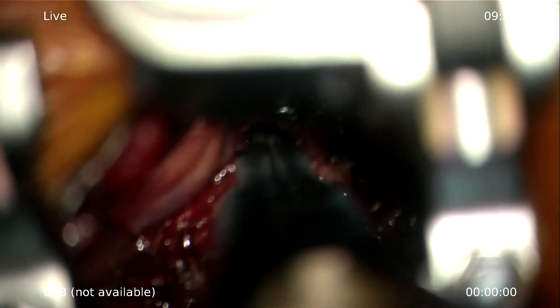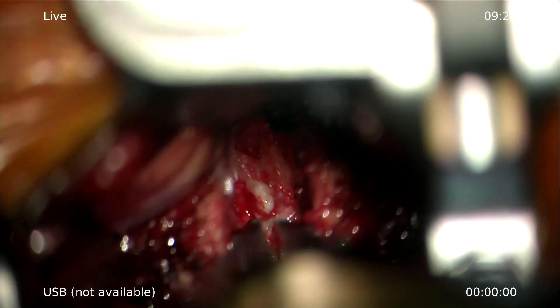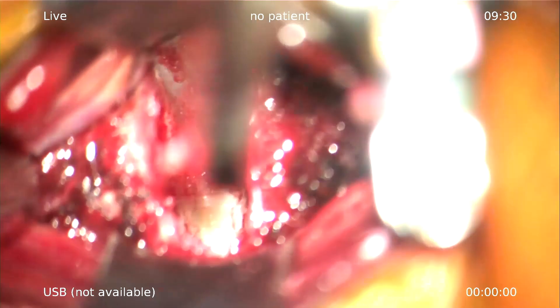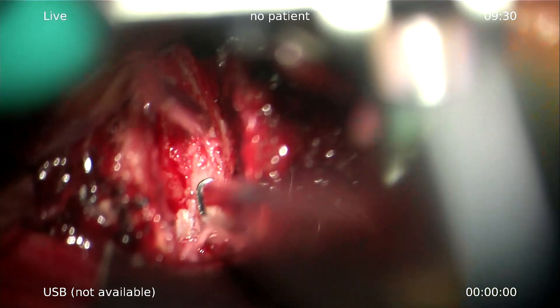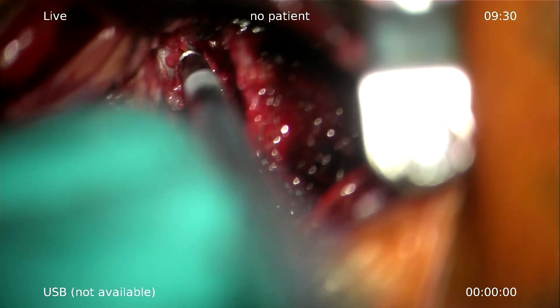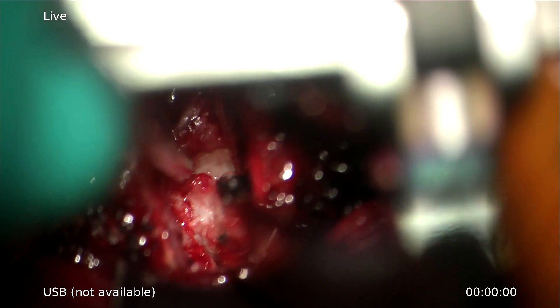If your release is good on both sides, you see it opening nicely in the middle. Of course, you need to do a proper decompression, opening the pathology. Here you can see the herniated disc pushing the spinal cord.